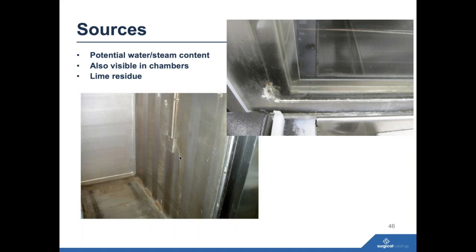I was just going to say, a very good friend of mine, Dr. Gerhard Kermsey over in Europe, who I used to work with, used a term called corrosion flu, and basically said that this rust, this staining, this corrosion can spread like a flu or like a virus from instruments to machines, from instruments to instruments to containers. So it's really important that you look at the entire process. But I really liked how he talked about that, calling it the corrosion flu.